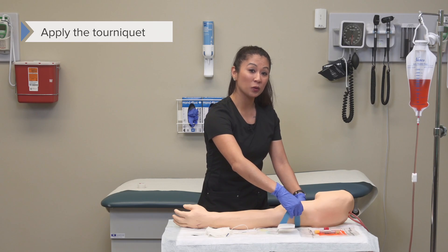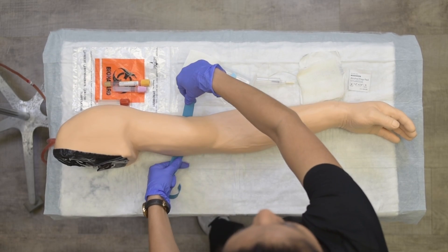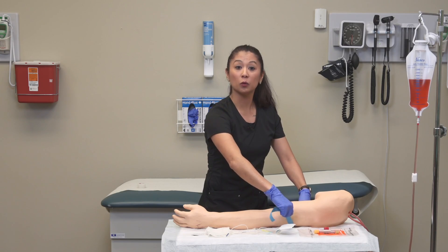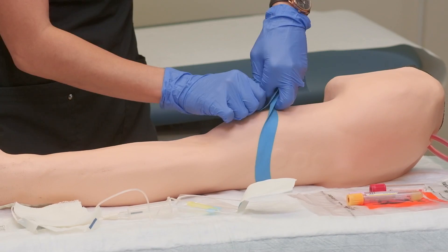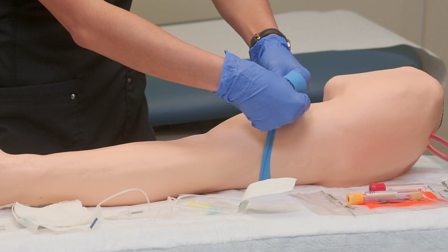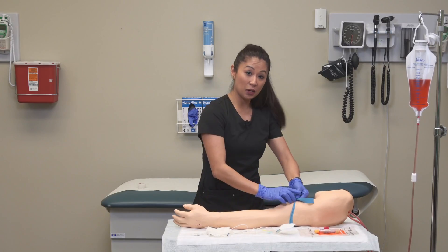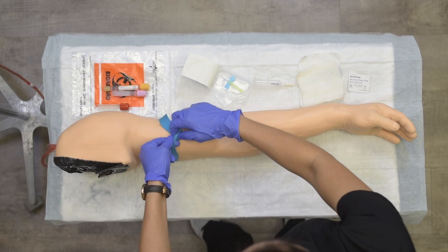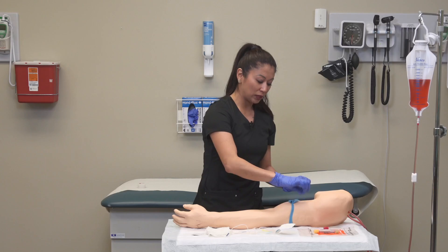When applying the tourniquet, I like to hold it a little bit closer to provide more tension. Then I cross my hands and gather it so you see a nice X shape. Then I poke through just this little side here, so when we're done we can quick release.